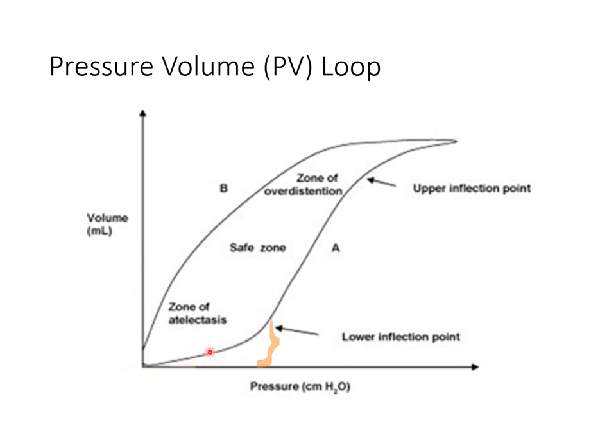If we give PEEP of 2, or you're not ventilating with PEEP, every time there will be collapse of the lung at the end of expiration and then they inflate. That will cause atelectotrauma. So we need to have PEEP so that we are above this lower inflection point.